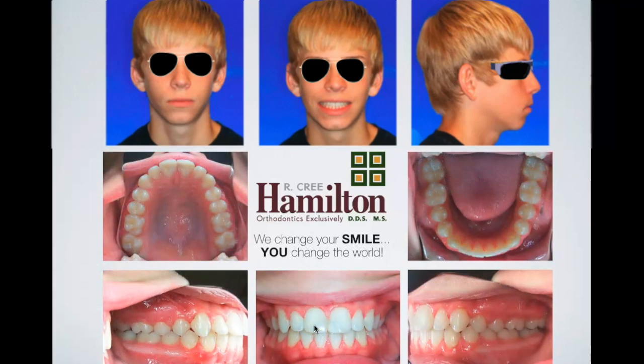But looking back at this result, I don't want to say I'm embarrassed. I mean, we did the best that we could with what we had at the time. But for me, yeah, the teeth are straight. They're aligned. The occlusion's good. But when you look at his smile, he's going to look like he's 10, 20 years older than he is his whole life, right? Because we didn't get that true increase in vertical that would have been ideal.